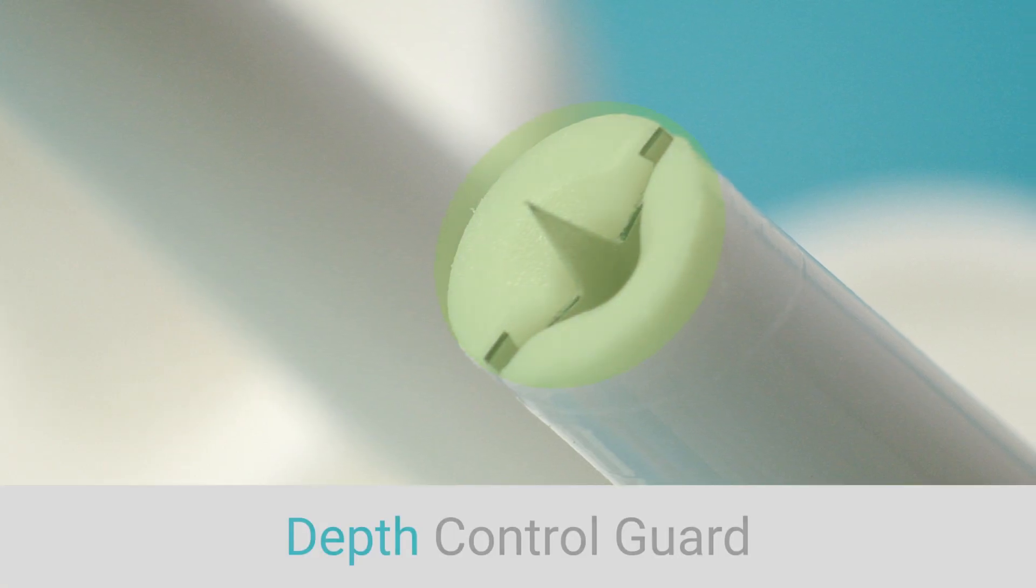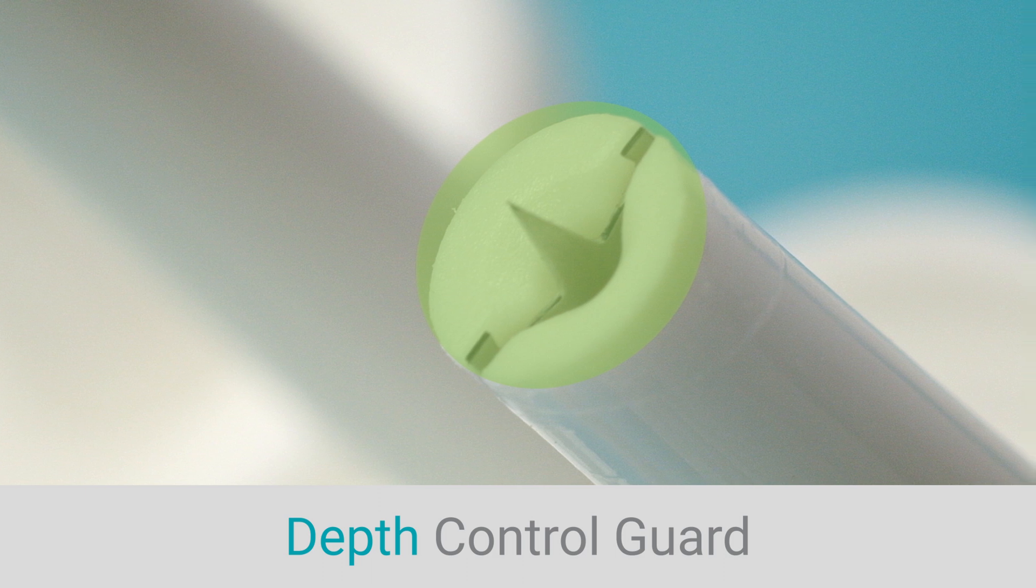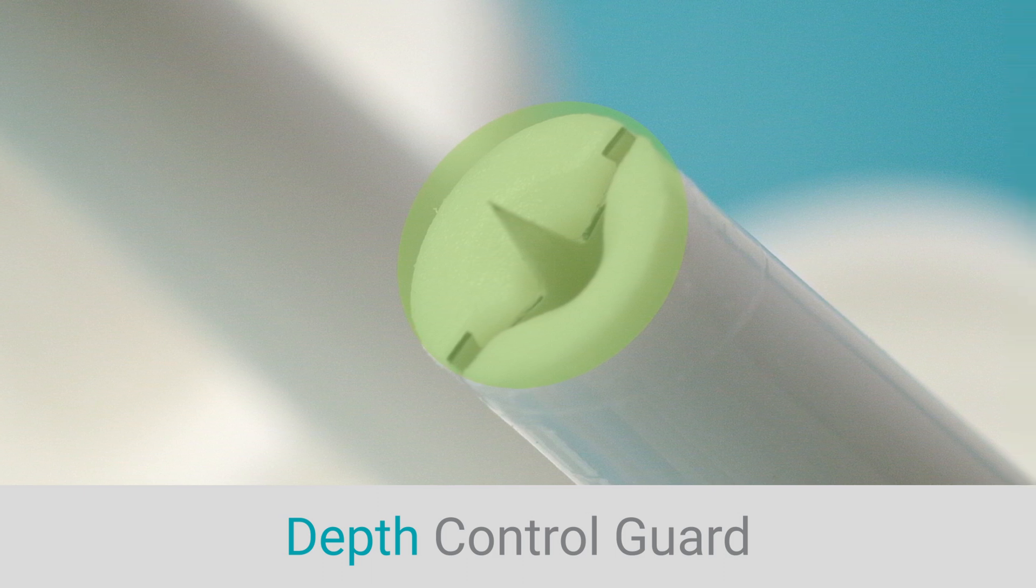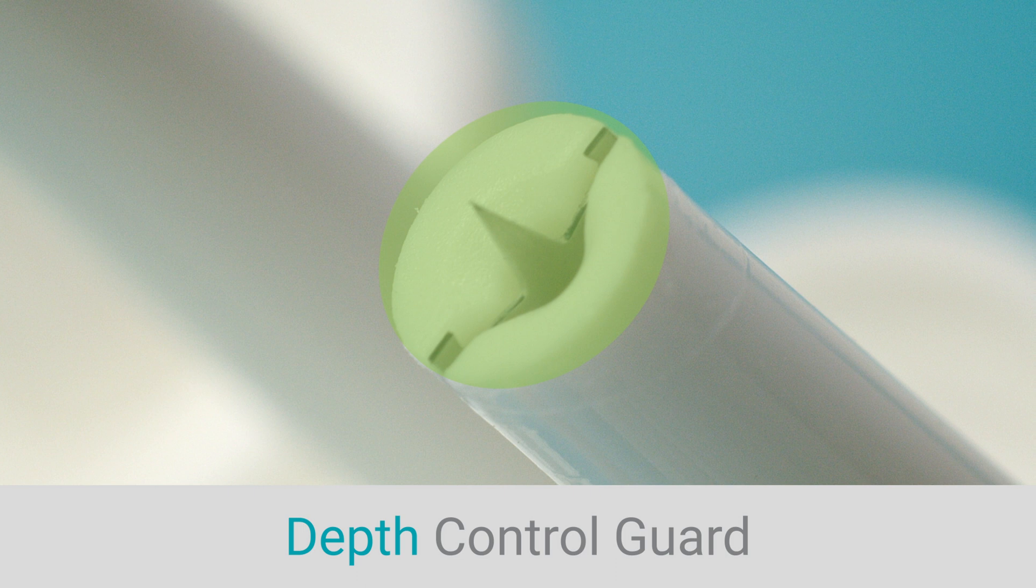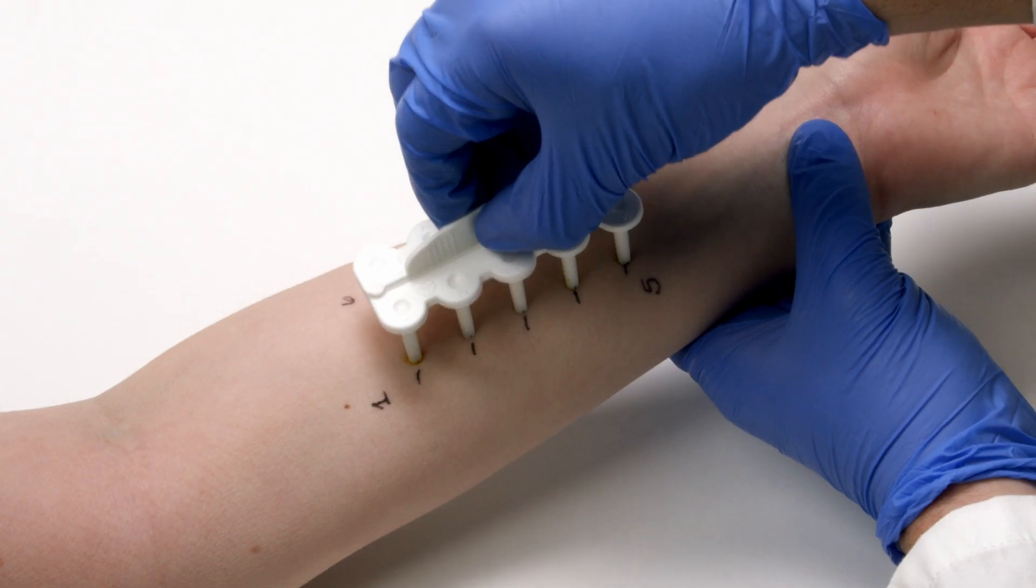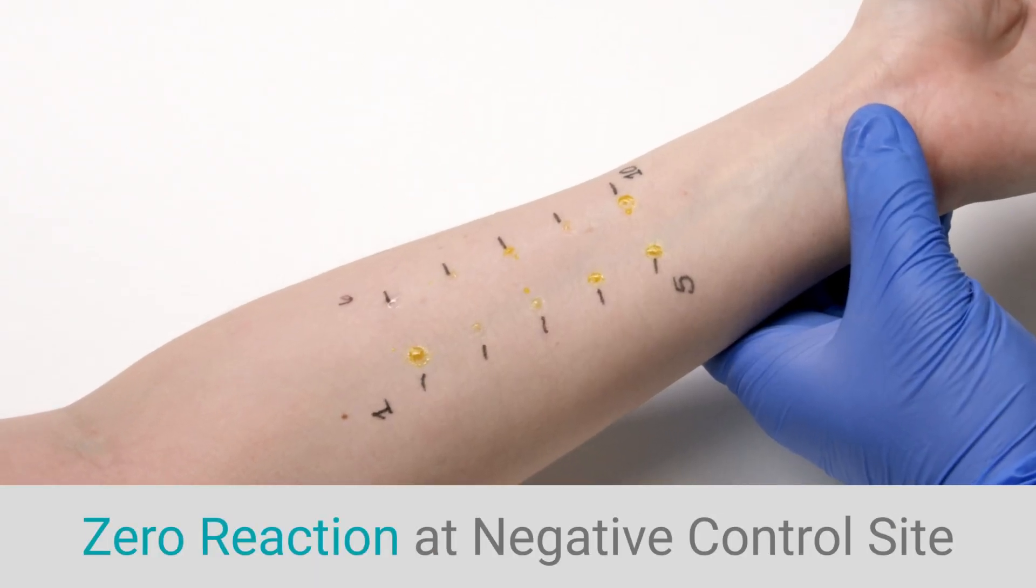Hollister Steer's skin test devices also offer a depth control guard allowing for reproducible skin test results for consistency among technicians. Our devices create zero reaction at the negative control site.